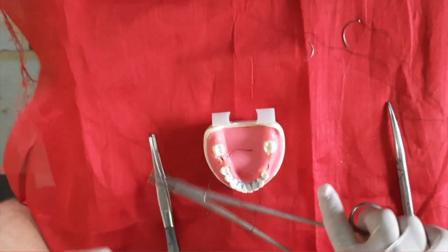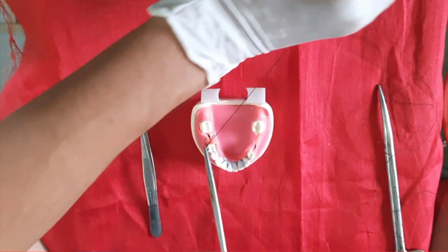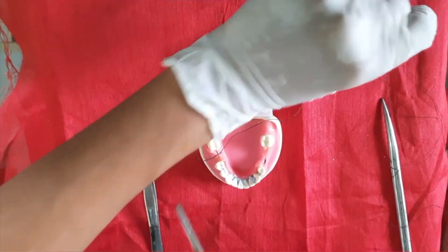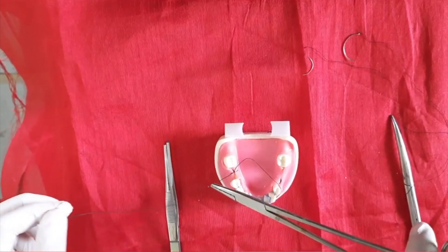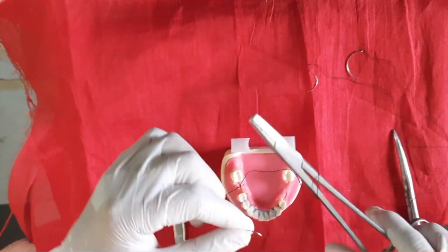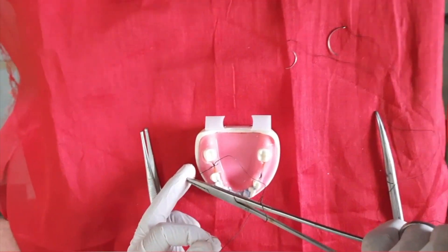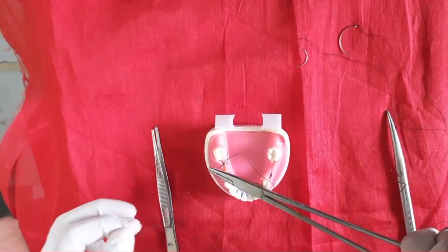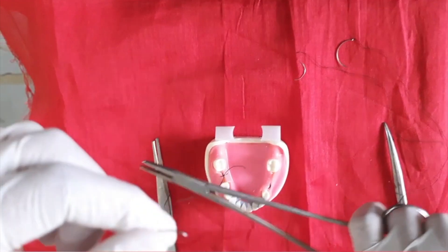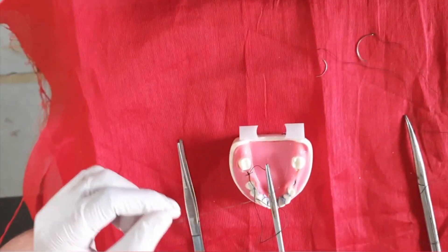Then hold the thread and round it around the needle holder two times for the first knot. Hold the other end tightly and make the knot. For the second knot, round around the needle holder one time only, hold the free end, pull it tightly. This is the second knot. Then for the third knot, again one time, hold it and pull it.